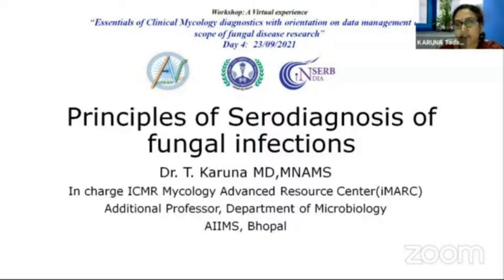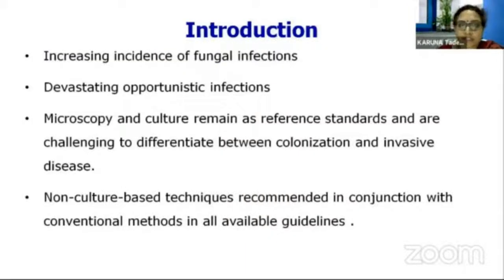So let us see the importance of serodiagnostic techniques and what we are trying to detect. So this is what we are going to cover. What is the need for serodiagnosis in fungal infections? We have seen an increasing incidence of fungal infections, devastating opportunistic infections. Microscopy and culture are our reference standards.